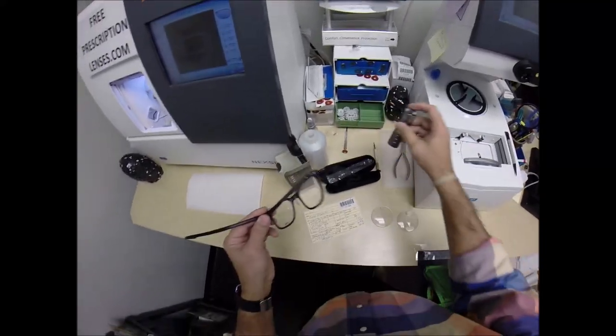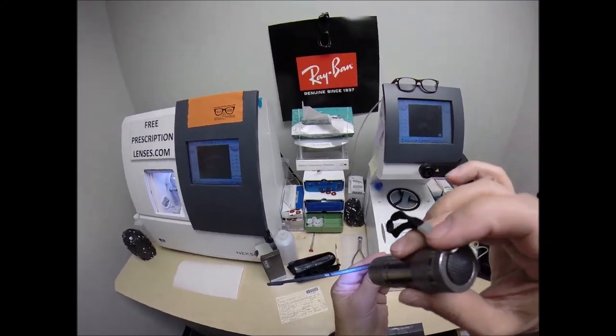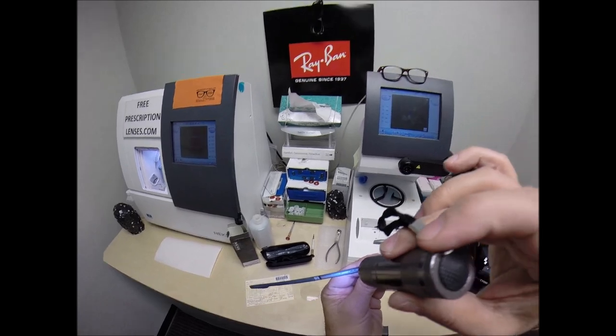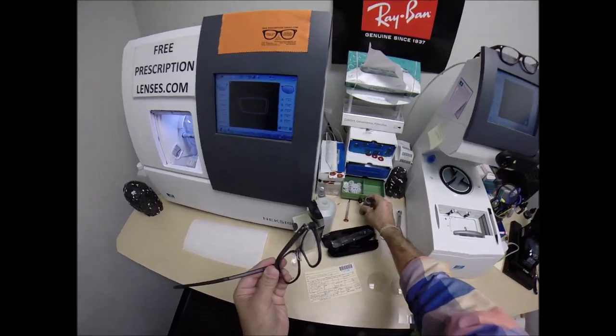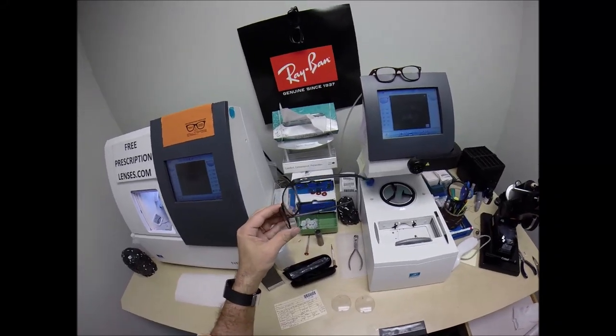And again, this is the Oakley 8093, the Milestone. And the color matte black ink in the 49 eye size. It comes in several colors, but only one size. So let me go ahead and begin.